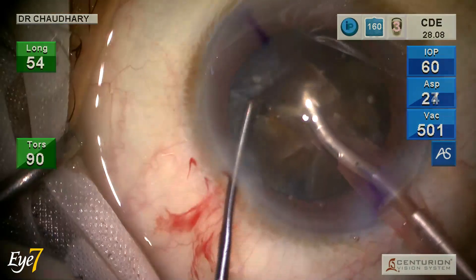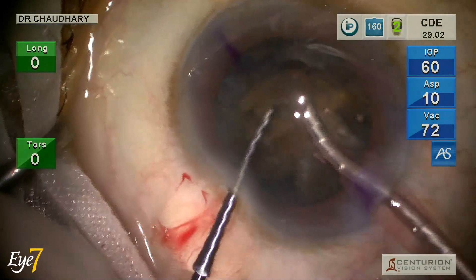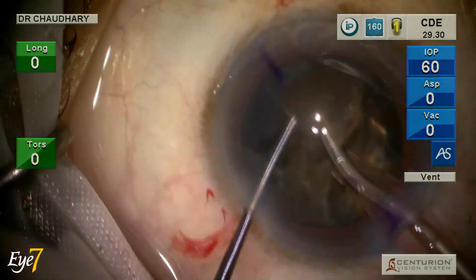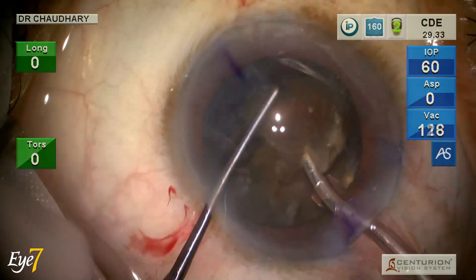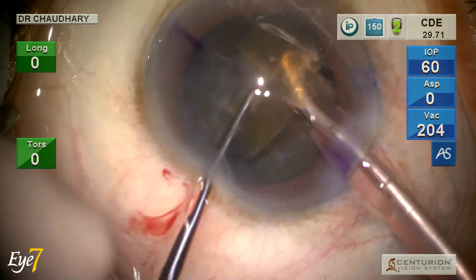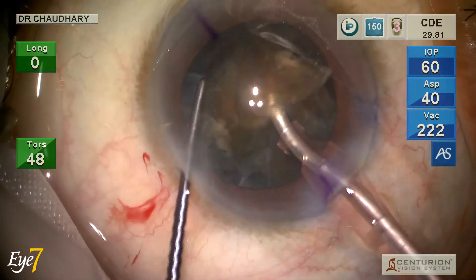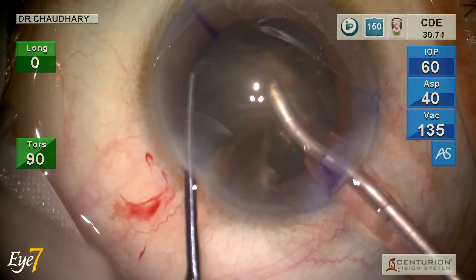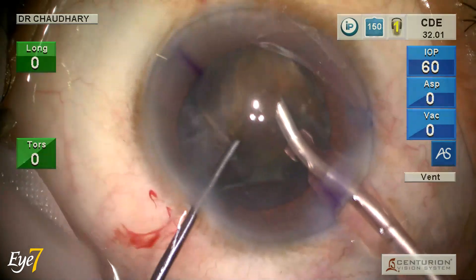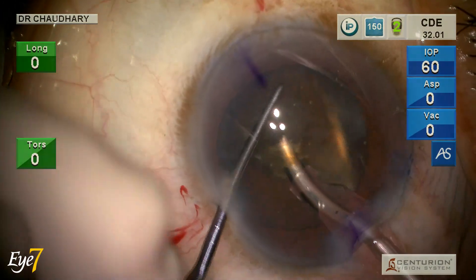The whole process appears fairly effortless. What is supposed to be a very complicated and dreaded situation in phaco — a hard brown-black cataract — appears to be well within control. After holding each nuclear piece, it is advisable to break it up into further pieces, which makes emulsification faster with less phaco energy consumed. Throughout the procedure the chamber is rock stable, and this is the confidence I get from the Centurion gold phaco system.